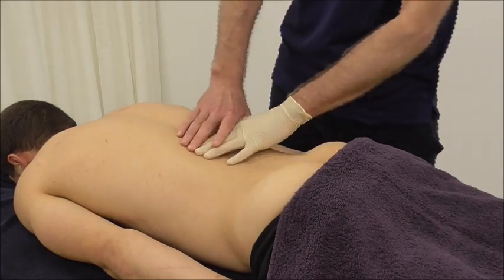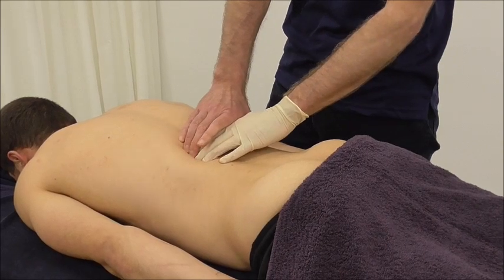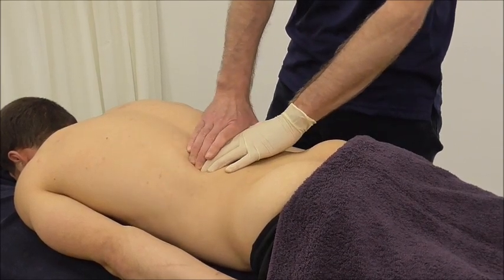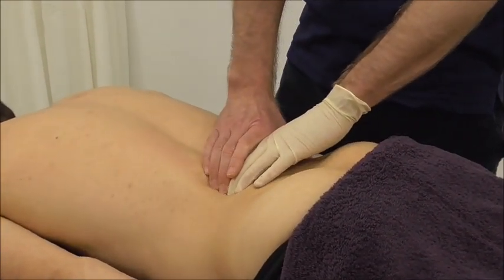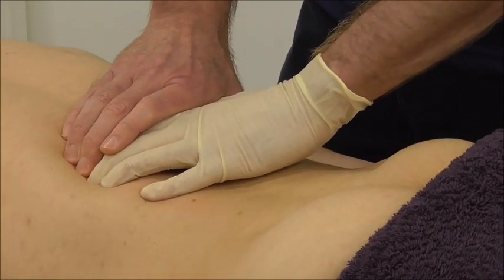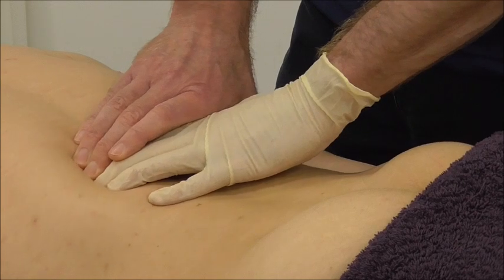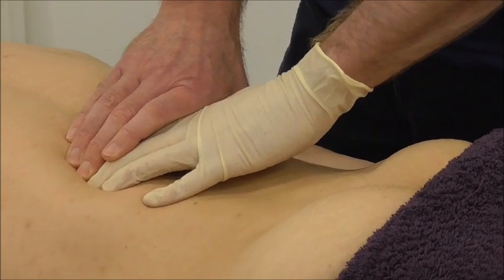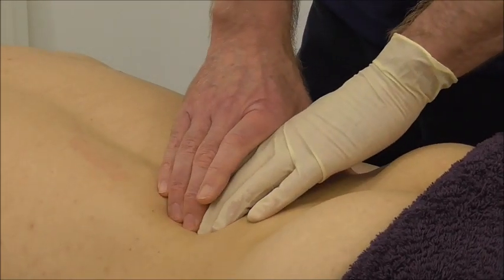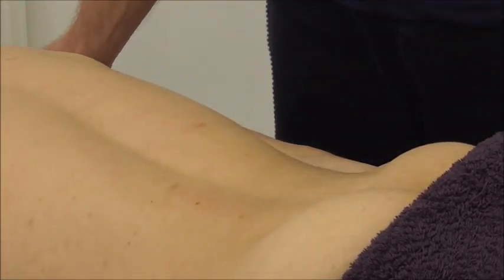We can palpate into this area using a flicking palpation, drawing the fingers inwards, looking to reproduce symptoms or find a taut band, which feels a little bit like a pencil lying within the muscle. As we flick over it, it feels slightly tighter. We do have a taut band in this area, but at the moment we're going to restrict ourselves to the lumbar spine. From L2 downwards tends to be the area most common in terms of mechanical pathology of the lumbar spine.